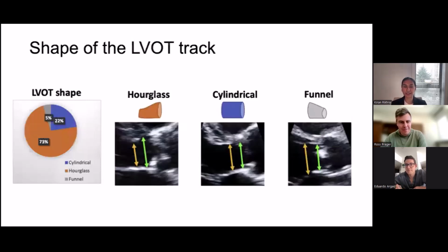Yeah, I think the key things are first recognizing that the most important value probably that you can measure, in my opinion, in any patient in shock is the VTI. But also knowing all the caveats that come with measuring the VTI and recognizing that while the absolute number gives you a hypothesis on your cause of shock, you need to test that hypothesis out. You need to start interventions for that patient and measure the changes in the VTI. So I think that's probably one of the most important things that I want to leave people with.